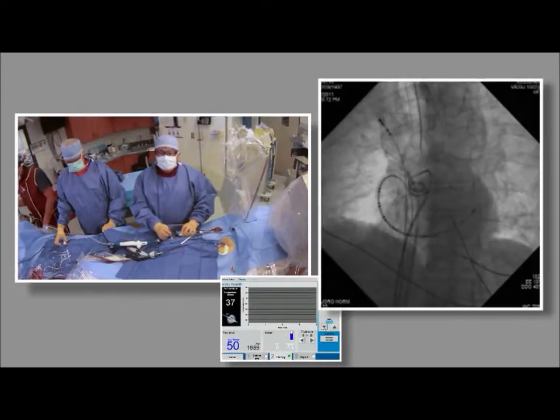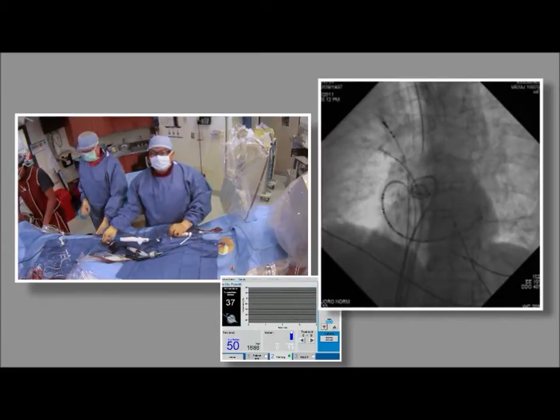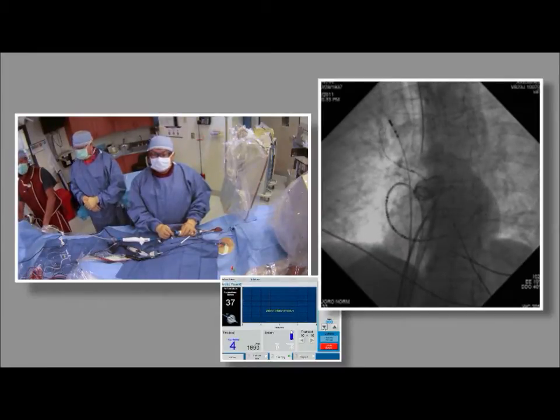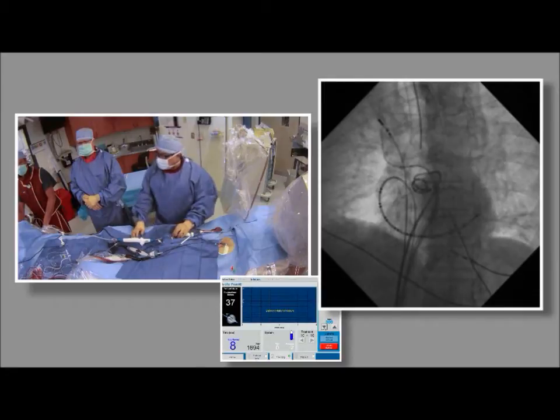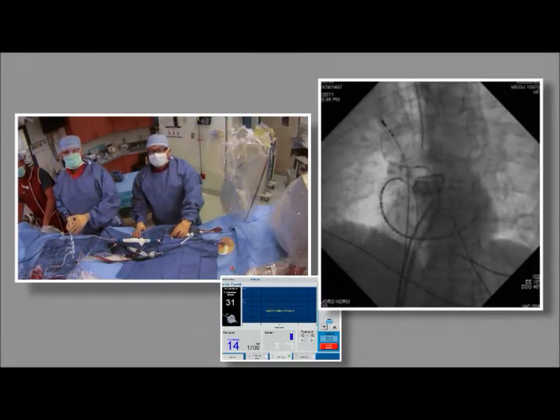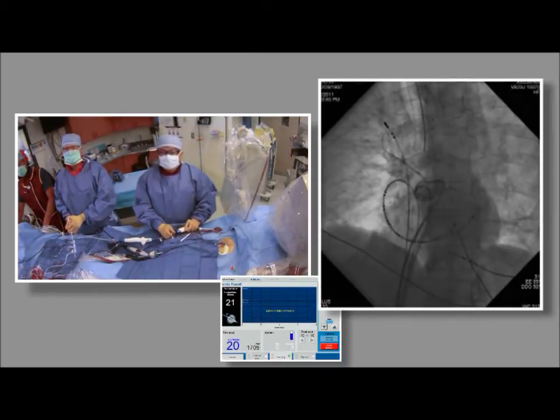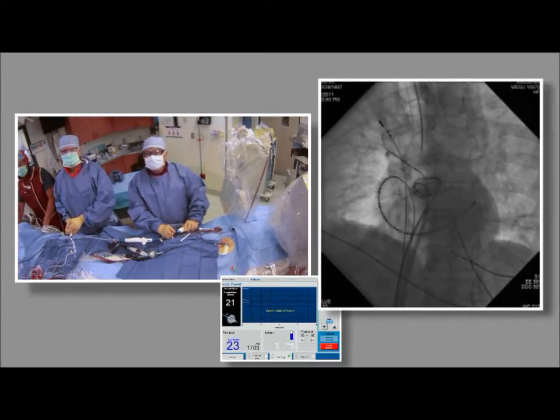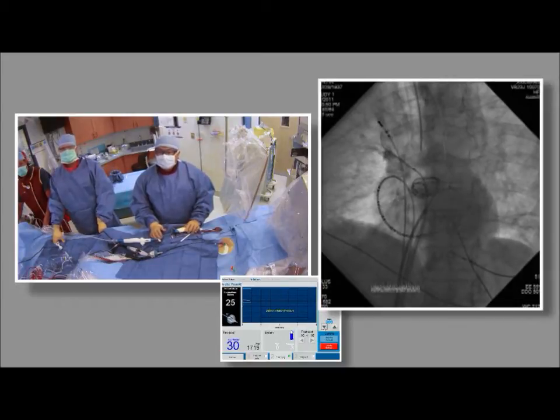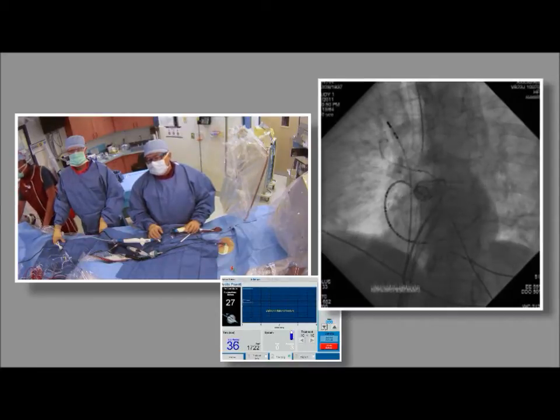Dr. Hsu completes a freeze-thaw-freeze in the right inferior pulmonary vein and moves to the right superior pulmonary vein. The balloon is pulled up and seated inside the vein. Shooting a venogram — there is an inferior leak. Quickly moving the balloon down to highlight where that is, and studying to find a better angle to look at this.